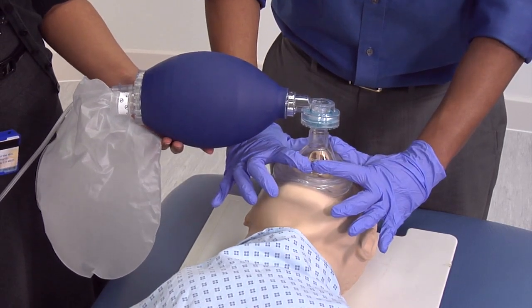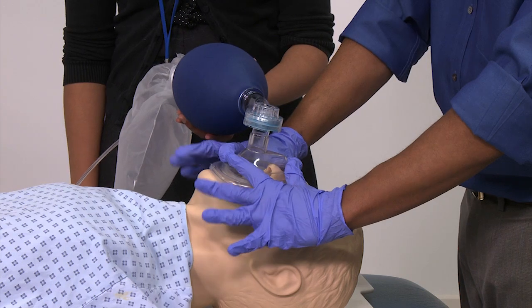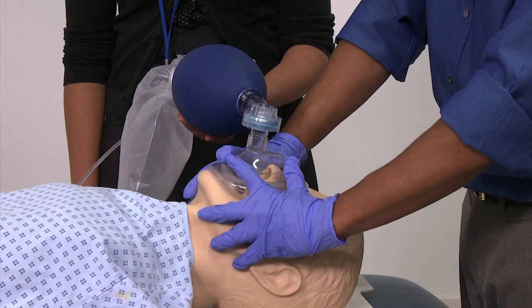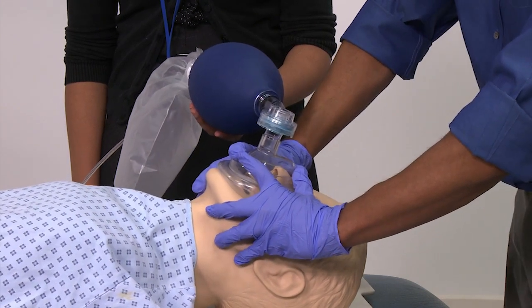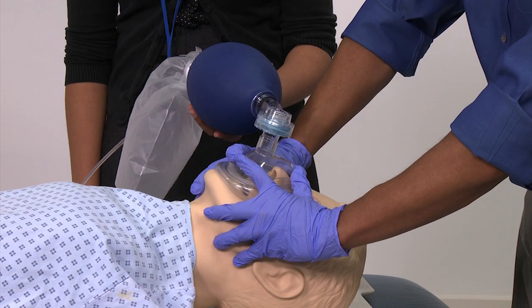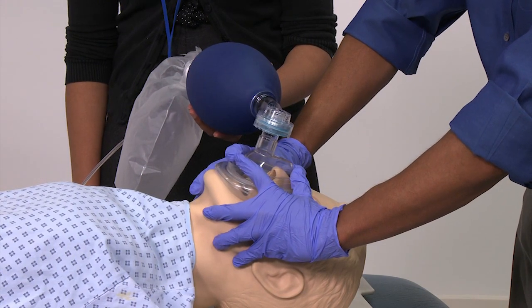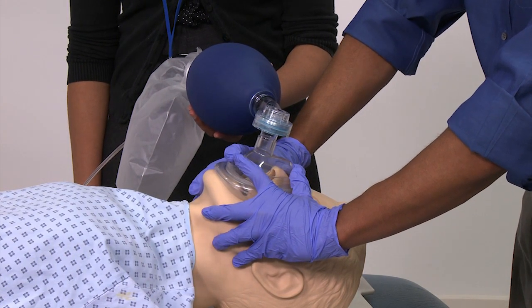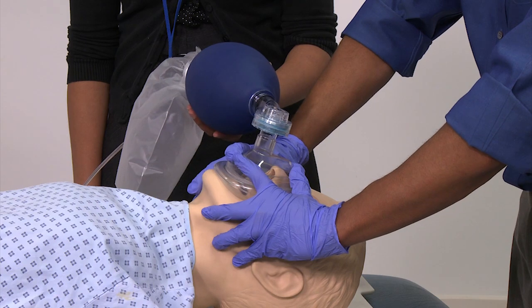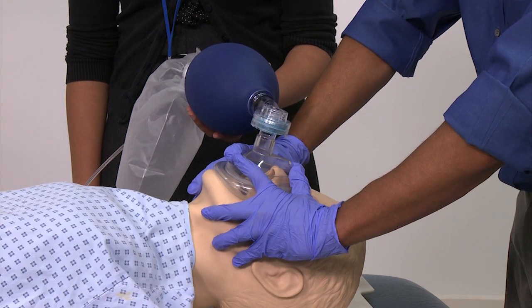Wrap the remaining fingers around the jaw and pull upwards to help open the airway further. Avoid putting too much downward pressure on the mask as you may inadvertently flex the head forward and reduce the size of the airway.